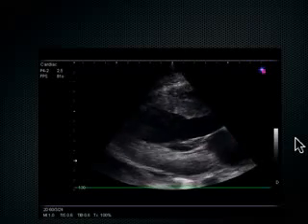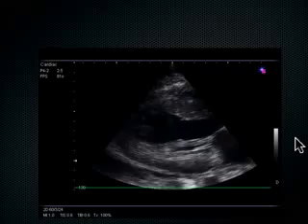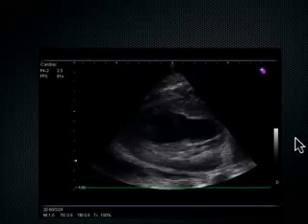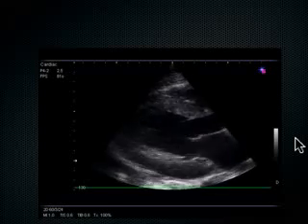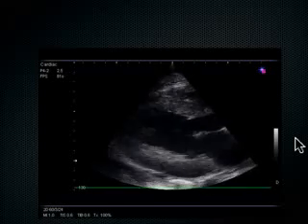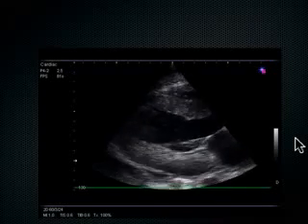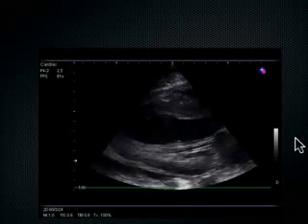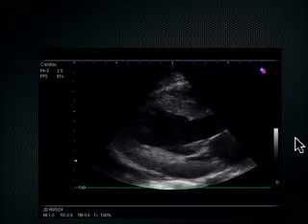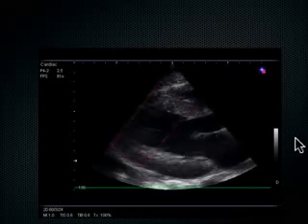And by the way, the reason why I look at that, it's the physical mechanics of the flow of the blood going from the LA to the LV. As it's being sucked through that valve, it smacks that valve up against the septum. If it's going through with a good enough velocity to do that, good enough pressure change from that LV working so well, it causes that septal leaflet to smack the septum. So when it's not doing that, we know there's decreased LV function. Does that make sense?